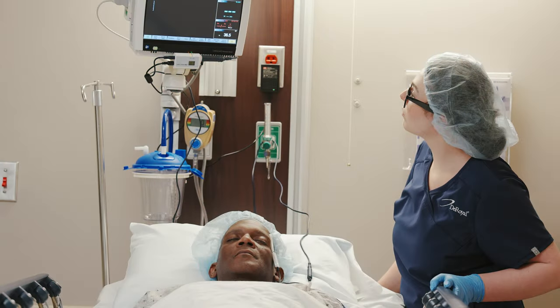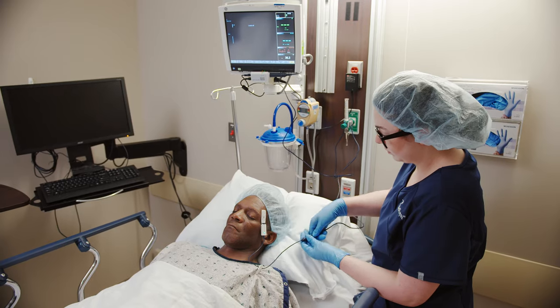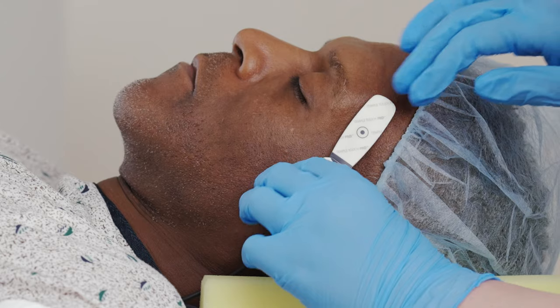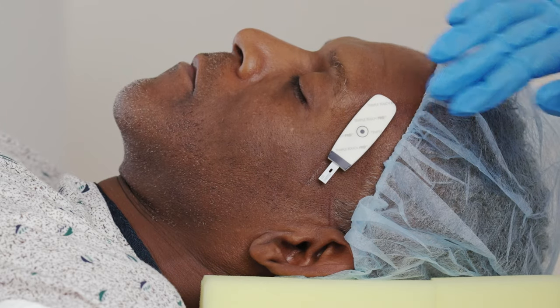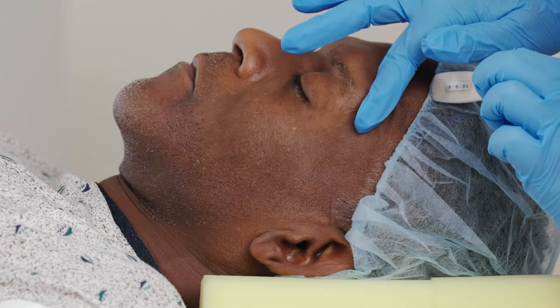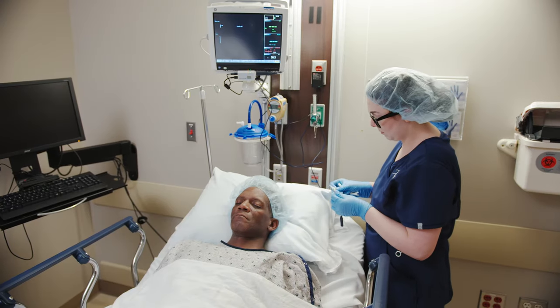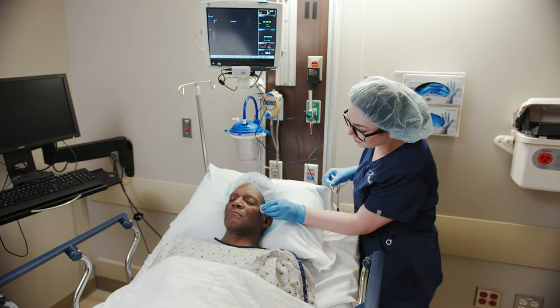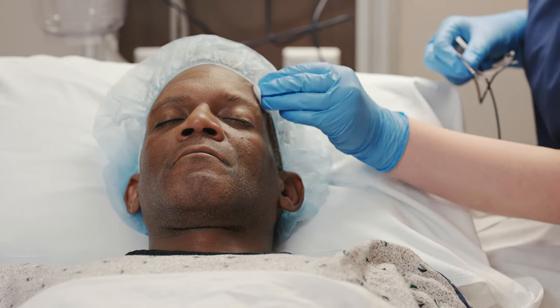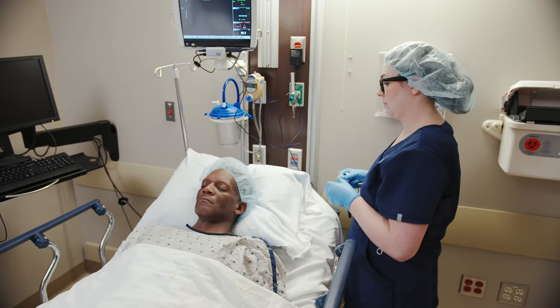When core body temperature monitoring is no longer needed, disconnect the cable from the sensor. Remove the sensor from the patient's skin by carefully pulling the tab on the edge of the sensor. If the sensor is not easily removed or leaves a residue, an alcohol swab may be used to help loosen or remove the adhesive. Dispose of the sensor in accordance with the facility's protocol and applicable disposal regulations.